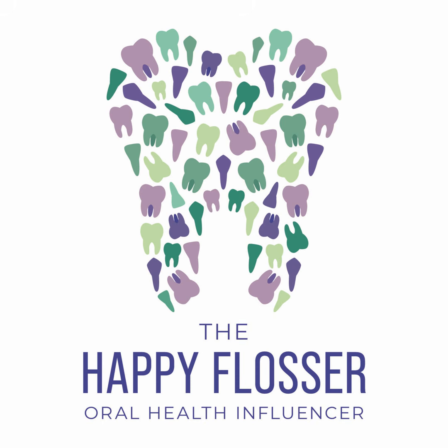When you are taking a full mouth series of radiographs that includes periapical films of all of the teeth and bite wing radiographs, you want to start with the anterior teeth first.